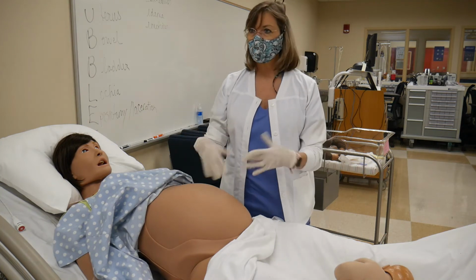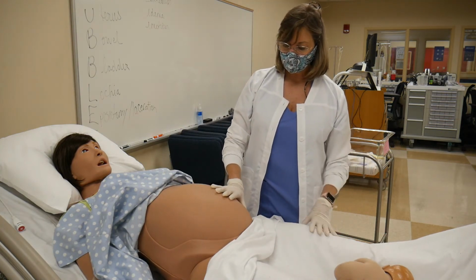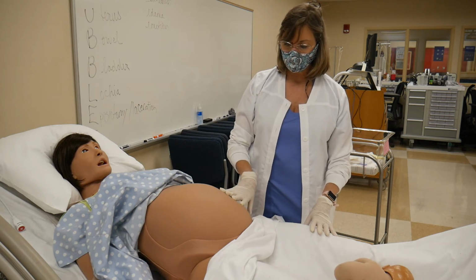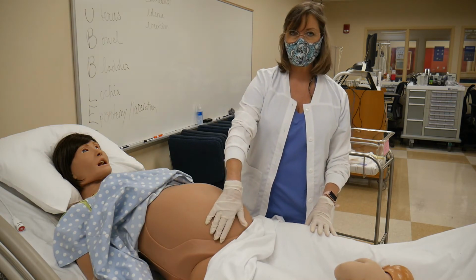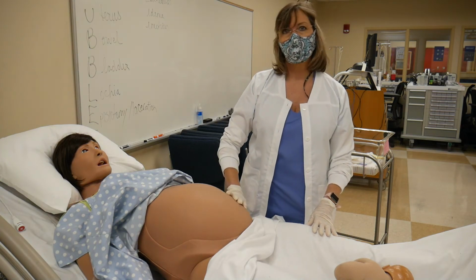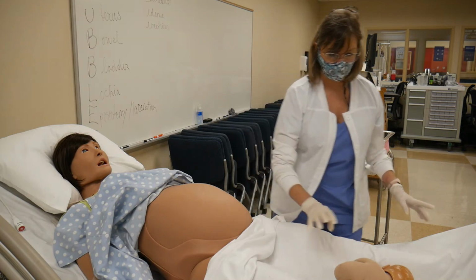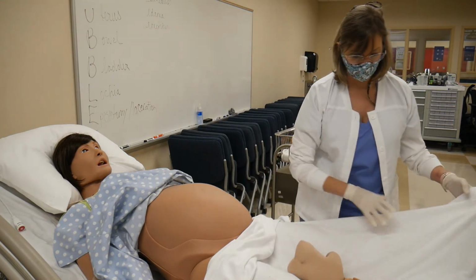Some babies move around more, and it's a little bit more difficult. So don't worry about it. Do learn about it and attempt it, but don't worry about it. Put the monitor over here. Can't find it? Try coming over here, and you can just kind of search around. So it's not going to be a big issue.